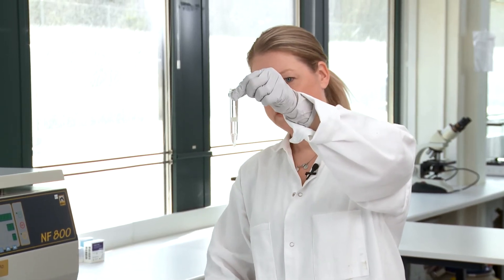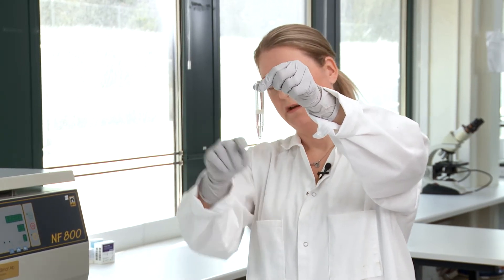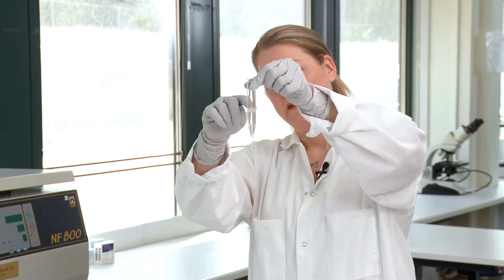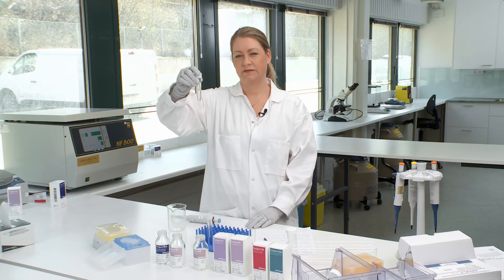When you're finished, a good gradient will have a clear raft in between the two layers and then the semen will be layered on top. Now the gradient is ready to be centrifuged.